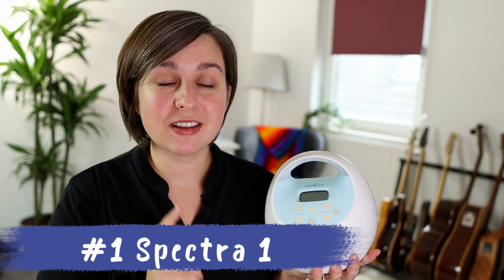And specifically the Spectra 1, which is the blue one here. The Spectra 2 is exactly the same. It's pink though, and it does not have a rechargeable battery. So you might think that's not a big deal. Like you're going to be sitting at your desk with your pump. It's going to be plugged in, that's fine.